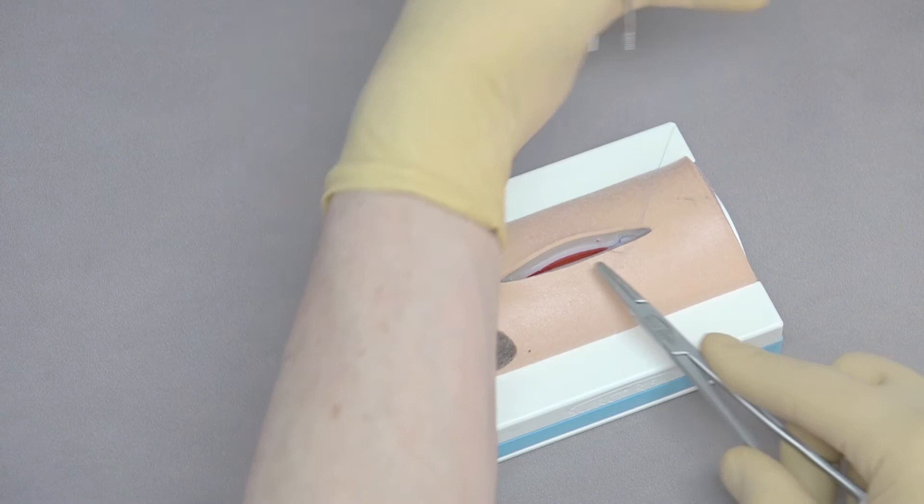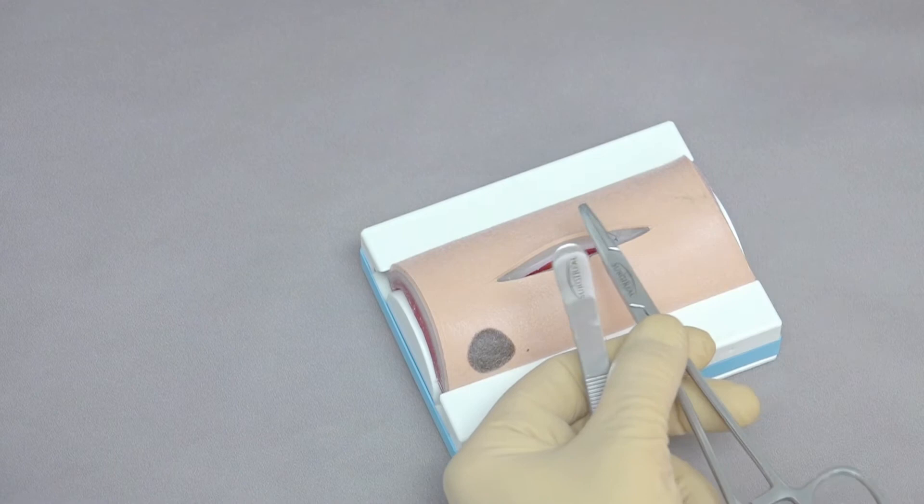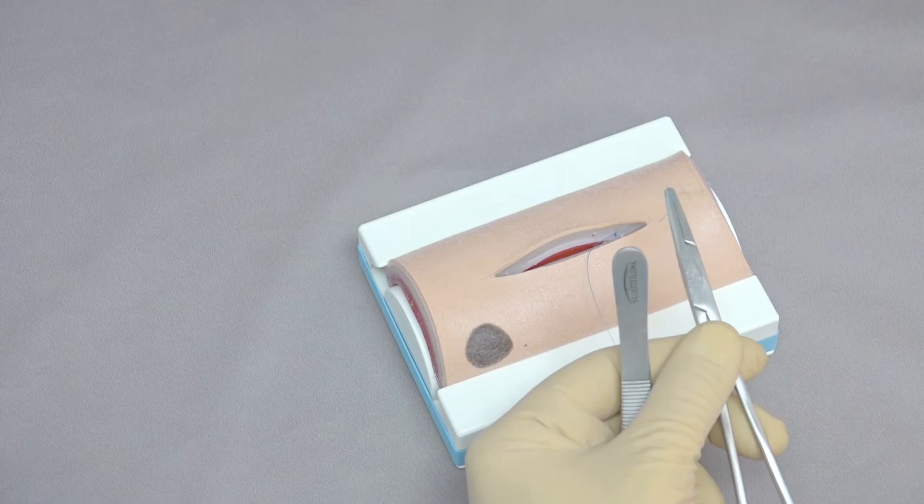Needle holders in the middle, around one time, come back, and tighten along there — and one more throw. A minimum of four throws is needed for a good square knot. Because this is going to be left within the tissue in our patients, we're going to cut this about two millimeters long.